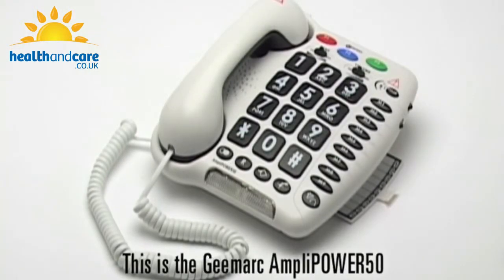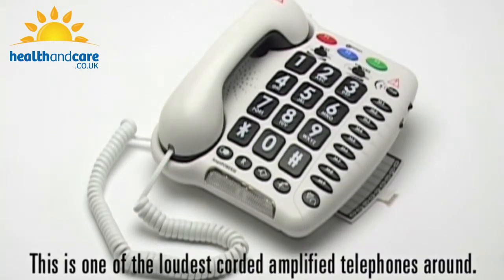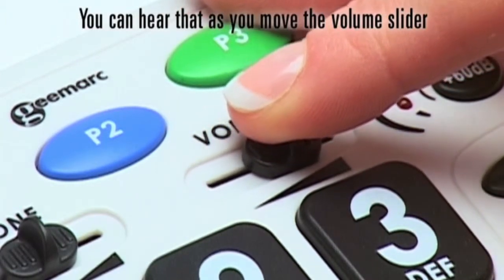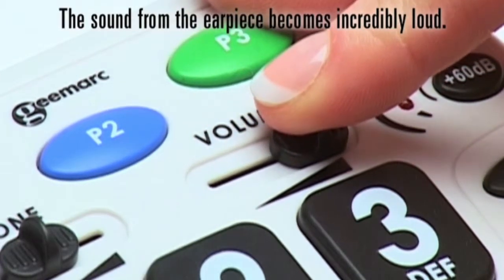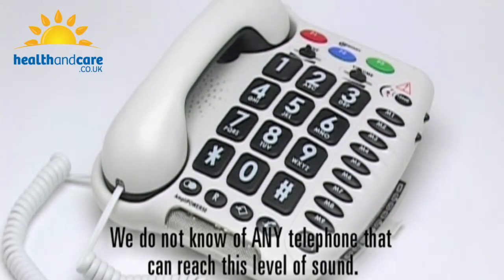This is the GMARC AmpliPower 50, an amplified telephone with volume and tone control. This is one of the loudest corded amplified telephones around. You can hear that as you move the volume slider, the sound from the earpiece becomes incredibly loud. We do not know of any telephone that can reach this level of sound.